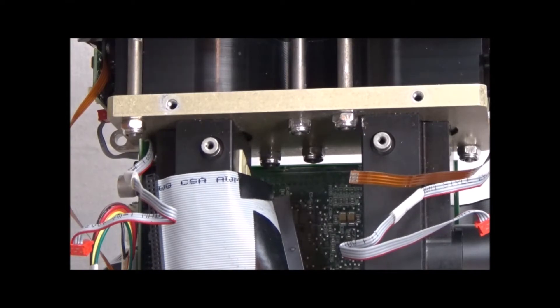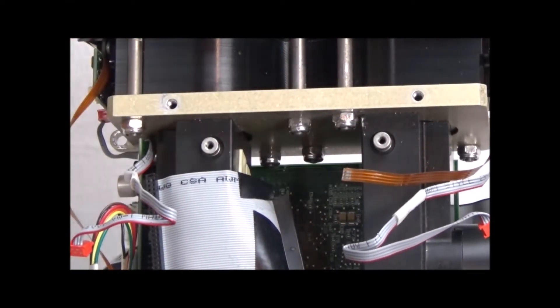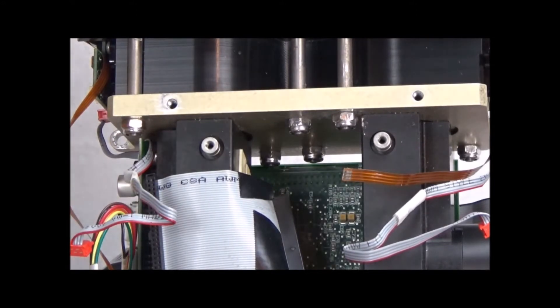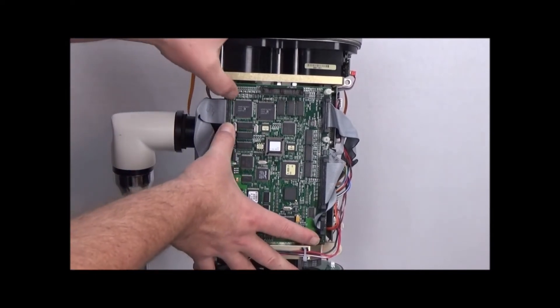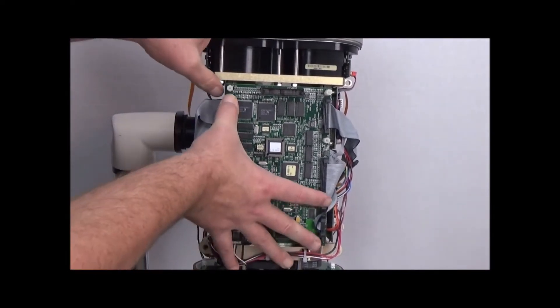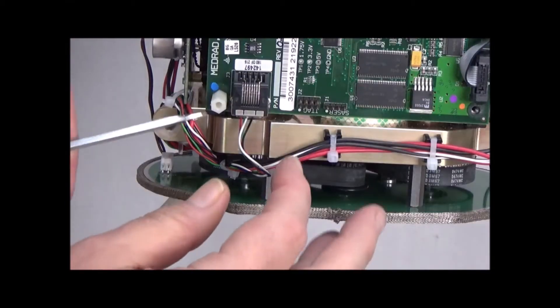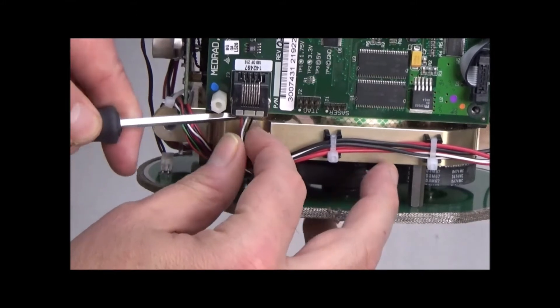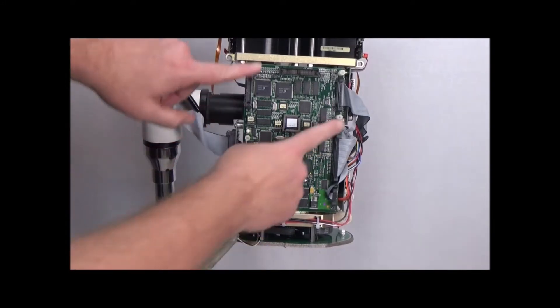What that does is it allows us to get to these three nuts right here. But before we undo those, we have to do the other side. This one's not as daunting — we just have to remove this connector to the CPU board, this connector down here, and these five standoffs.